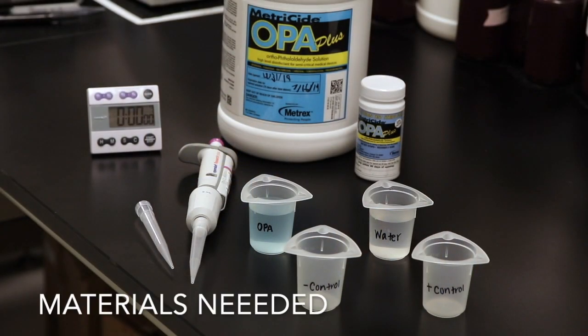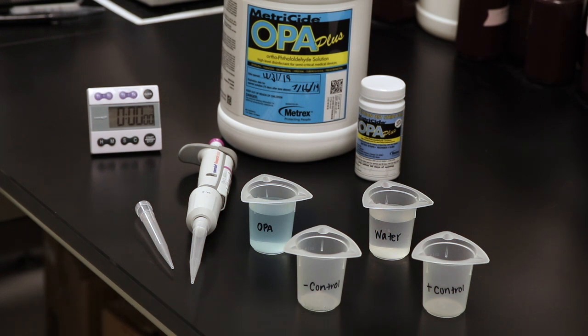The following materials will be needed to perform the QC test: unexpired Metricide OPA Plus solution, a new bottle of test strips, beakers, at least 15 milliliters of potable water, a pipette, and a timer.